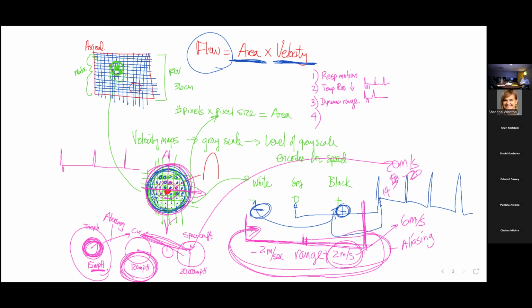So you need to remember, and that's going to be relevant. Let's say you've got a patient with a suspected atrial septal defect, right? Let's draw our heart here. Here's our RV, here's our LV, and we want to know, is there blood flow going across here? Well, if we set the phase encoding direction this way, we're not going to see it. Or if we do it through plane, like we're doing for the blood vessels right now, we're not going to see it. It needs to be set left to right.